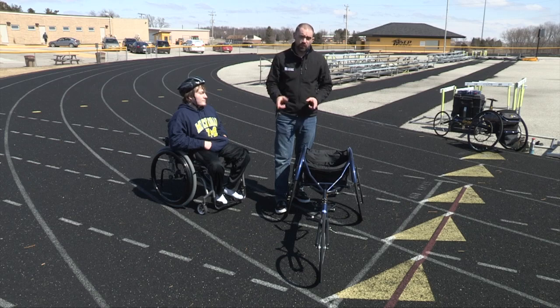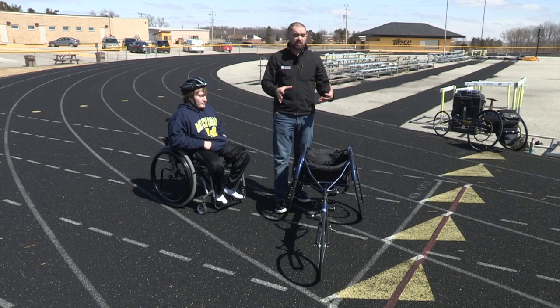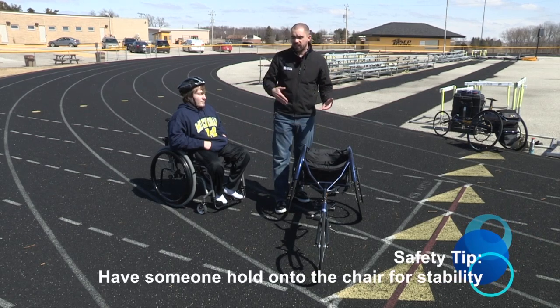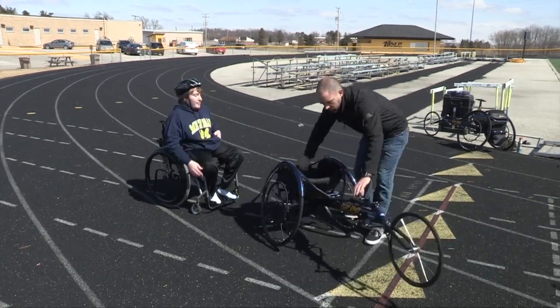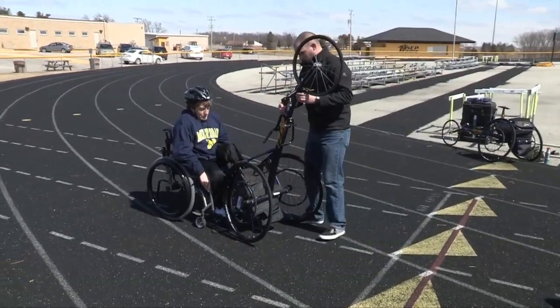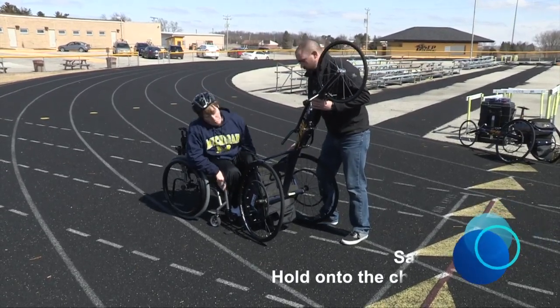It's important while you're doing this, especially the way that we're going to be doing this with Jordan, is you need assistance. You need someone to hold onto the chair to keep it stable. That way as he's getting in, you reduce the risk of injury. So bring it right up to the front of him, lift it up so he can get easy access into the chair. Make sure you're holding onto the chair firmly.